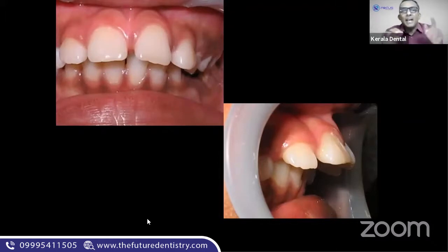How much is this overjet here? Can somebody type in the chat box? Sarah, please do something. Yeah, oh, wow. 8 to 10, 8 to 10, 8, 7. Perfect. Yeah, this particular kid has an overjet of, believe me, 13.5 millimeter.